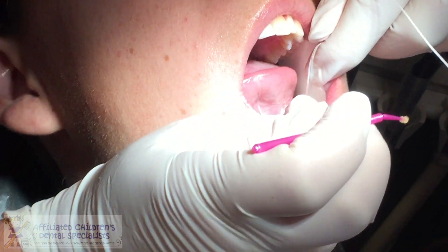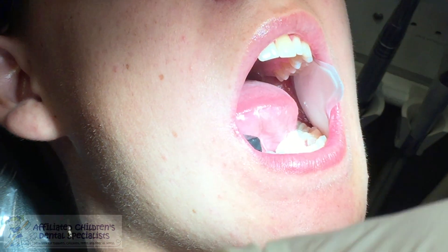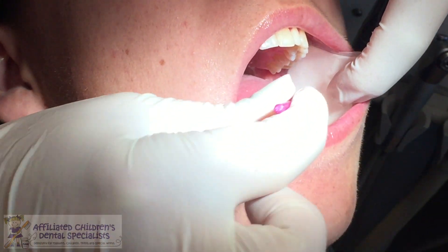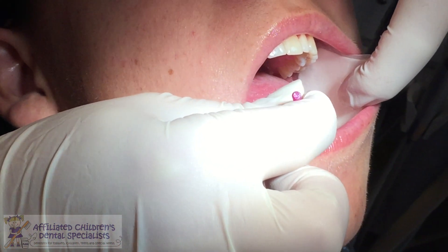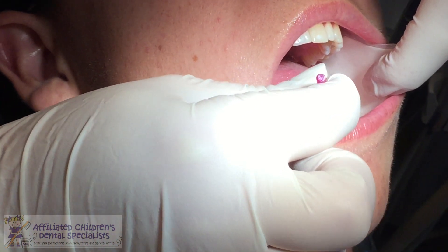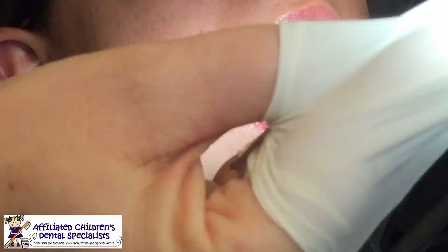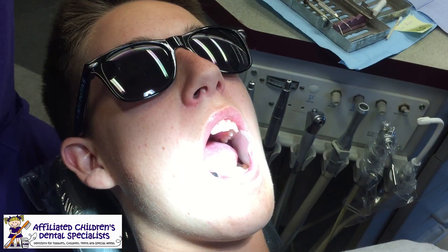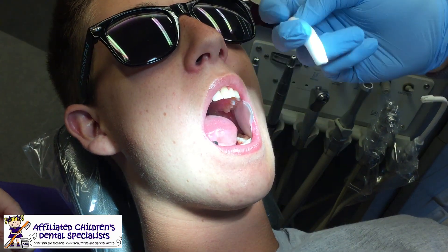All right, it's been a minute. I'm going to pull this straight out of the contact so I don't rub it against anything. Now I'm going to put — this is Elevate's Floramax Varnish — I'm going to paint it over the contact area just to help keep saliva out and improve the flavor. Ta-da! Then you want to invert your glove and get all the SDF things that were touched safely away. Sherry, do you mind taking out the cotton roll and the dry angle for me? And he's done!